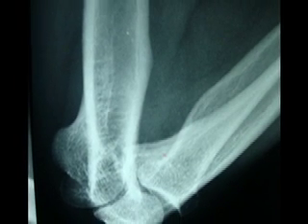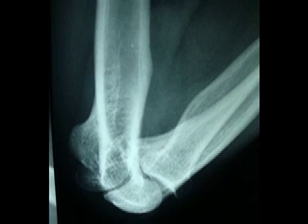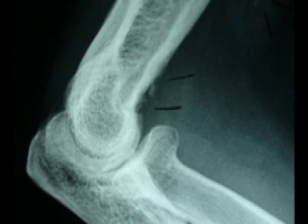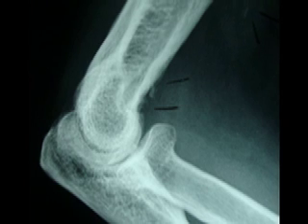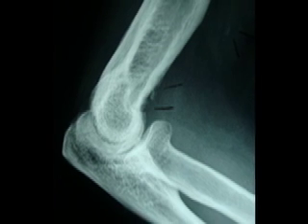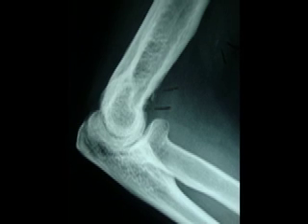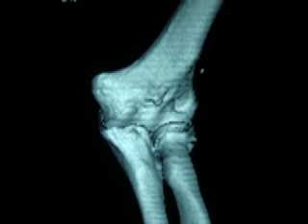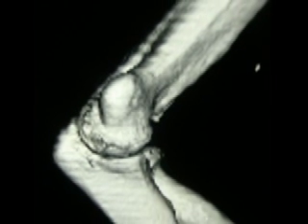This is a plain lateral view in full flexion of his left elbow, in which we can see no bony problems. And this is the lateral view in full extension, in which there is no evidence of any kind of bony problems either. We asked for some CT scans, and the CT scans revealed a quite preserved bony anatomy. This is the lateral view, in which we can see the lateral column, and this one is the front view, in which we can see a quite normal distal humerus bony anatomy, and this is the medial view, in which we can see a quite normal humeral joint.